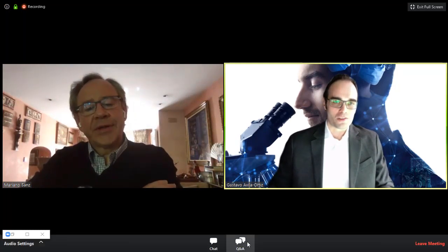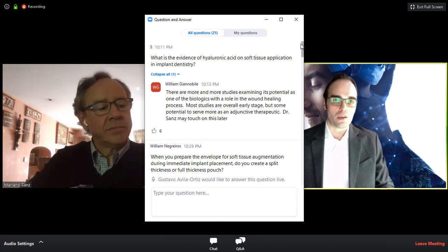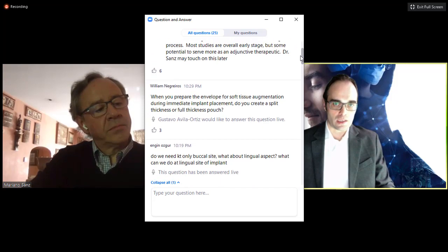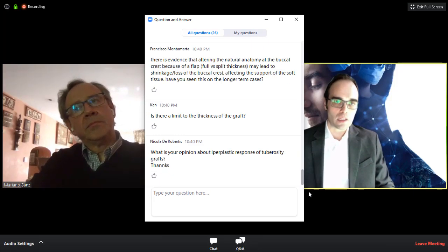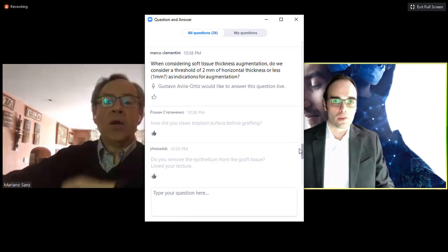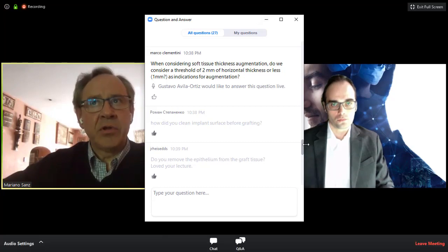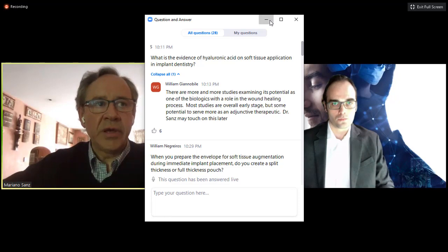One question that was consistently asked by many different people was related to the technique in terms of augmentation of pre-implant soft tissue thickness. And the question is specifically about whether you create a split thickness, full thickness, why and in what circumstances you choose one or the other. Well, I always aim the split thickness. In that way, I will have double blood supply to my connective tissue graft or to the matrix.